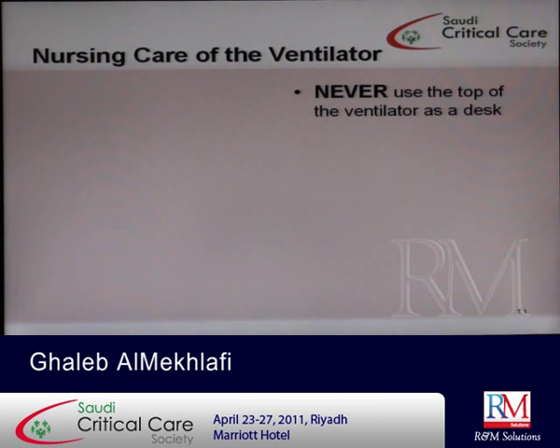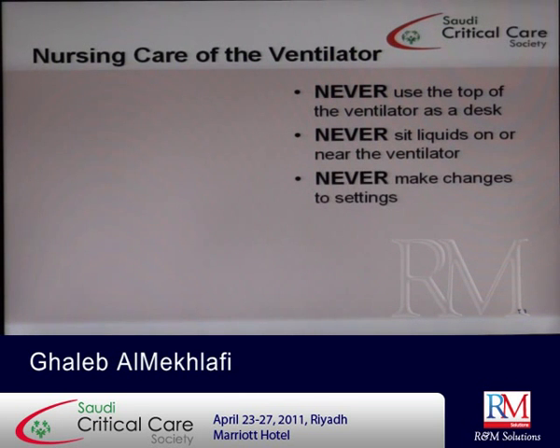Now, caring for the ventilator and also caring for the patient. So how do we care for the ventilator? You should never use the top of the ventilator as your desk and put your coffee on it. And you should never make changes to the settings unless you know what you are doing, because it can be fatal. If you don't know, then you have to refer to the RT, the medical doctor, or the nurse in charge to make the adjustment.